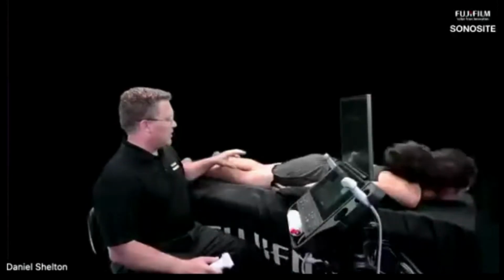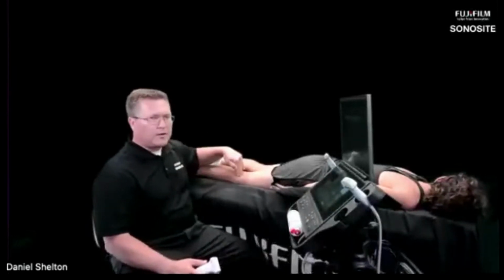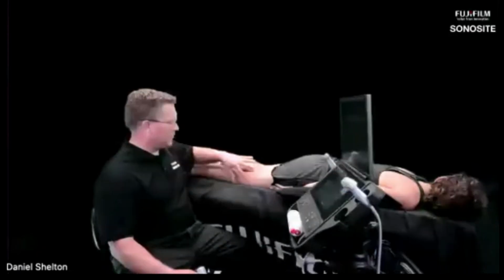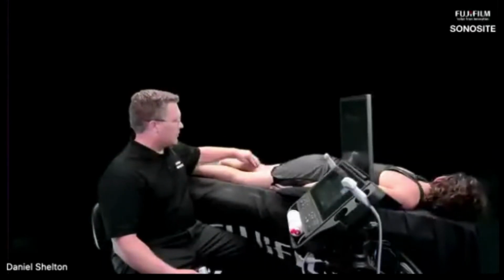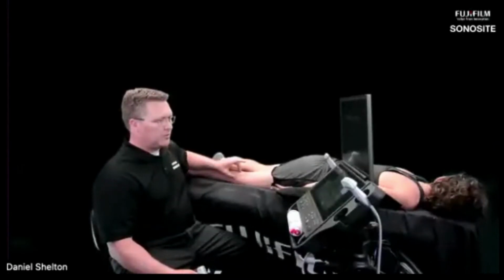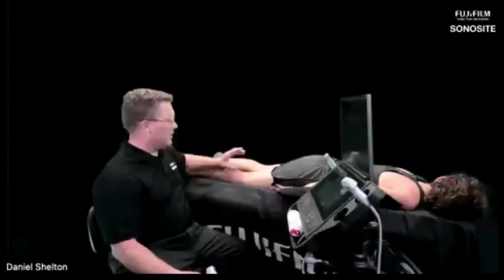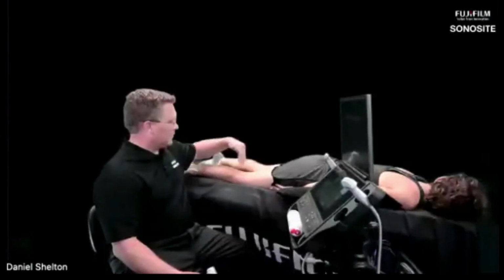Because we're going to be scanning both medially in some cases and laterally, once we get over to the peroneal nerve anatomy, for example, in the biceps femoris, I may start off scanning this part of the knee for the camera and then just switch over to this part. So if at any time somebody can't see something super clearly, just let me know. But basically we're going to be scanning cross-sectionally.